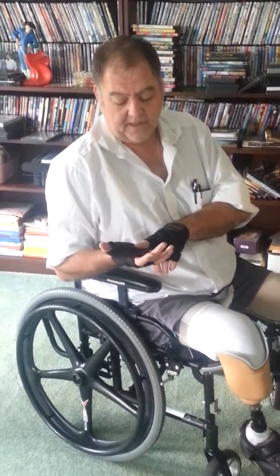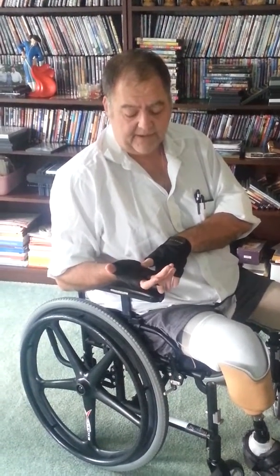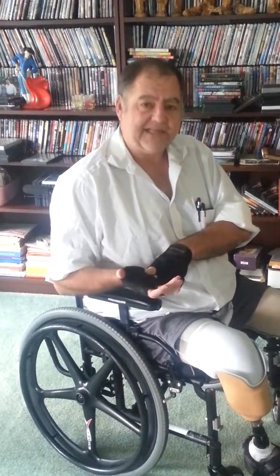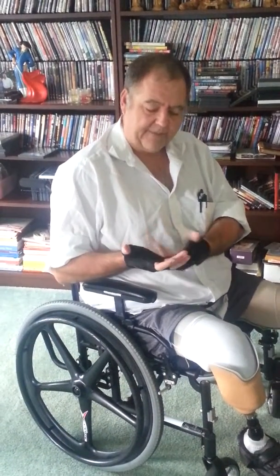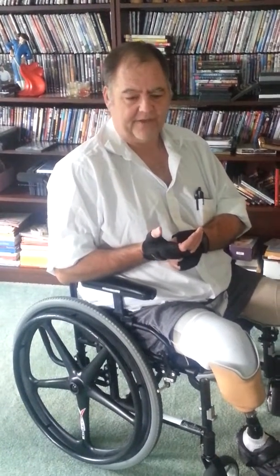So now I don't wear gloves when I'm inside the house or at somebody else's house. But anytime I go outside, when I'm actually going to be working and moving my wheelchair, I wear gloves. That is just one of the reasons why I started doing that. Over time that callus has gotten a lot softer, and there's no more concern about that.